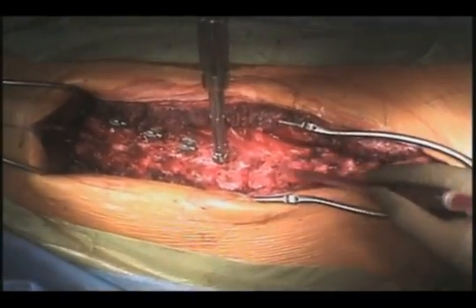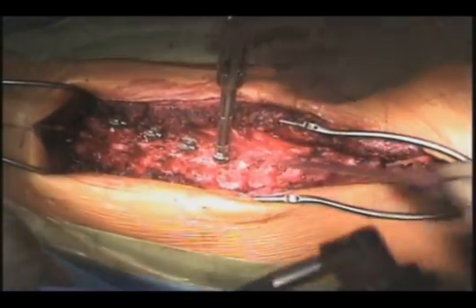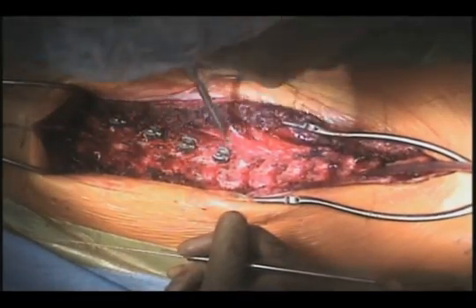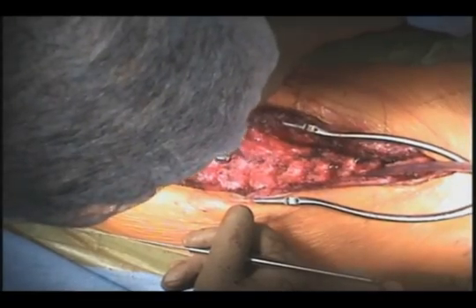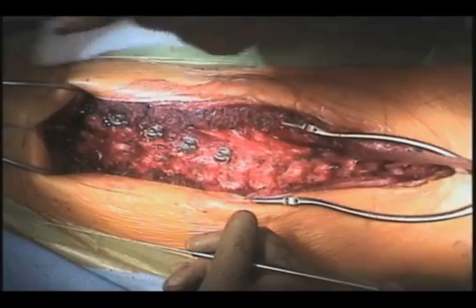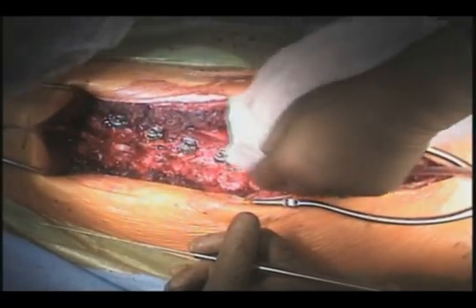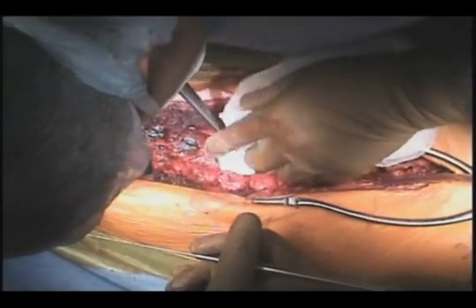And you can see the mobility of the spine now after having performed the removal of the ligamentous structures, the interspinous ligaments, the supraspinous ligaments, the facet joints being facetectomized, and then Ponte osteotomies at four or five of the apical segments. I use again this technique of burring followed by the drill bit, and we use anatomic landmarks in the areas of Ponte osteotomies. I am able to use a Woodson probe, a dental probe, to palpate the pedicle if there's any question.